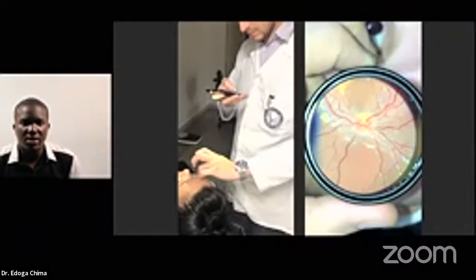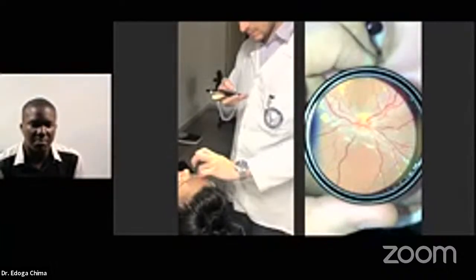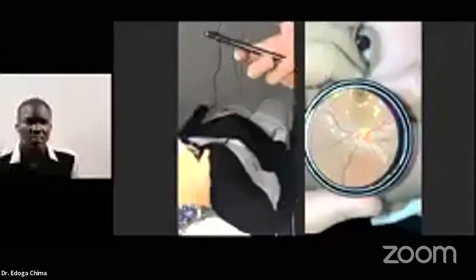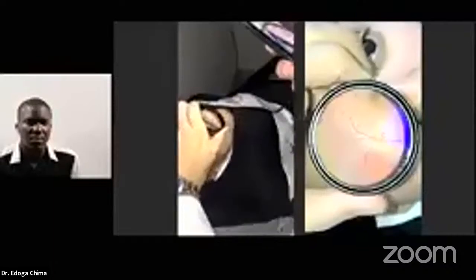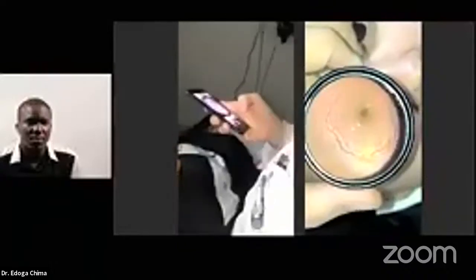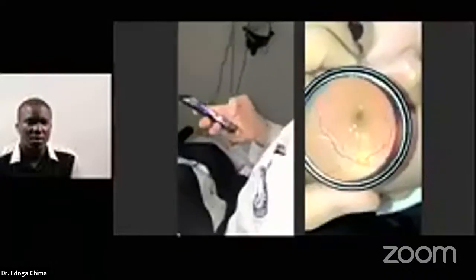Okay, so I'm going to continue the video now. The lens is 5 centimeters from the eye, and the smartphone is 20 to 30 centimeters from the lens. With this setup, the lens should completely fill the smartphone screen. And make sure to keep it. So this is the freehand technique, and the camera.